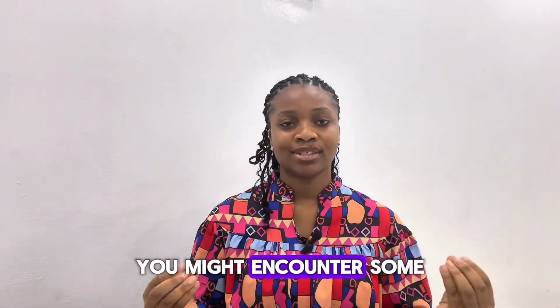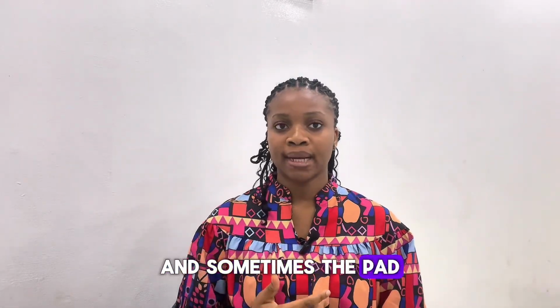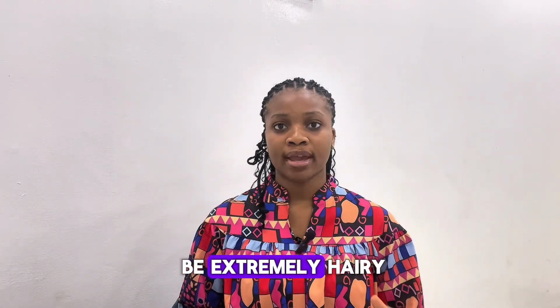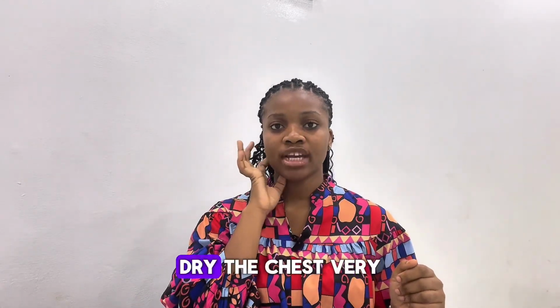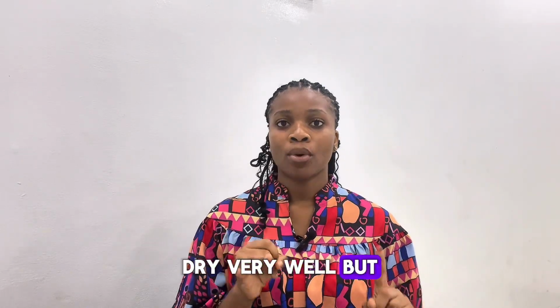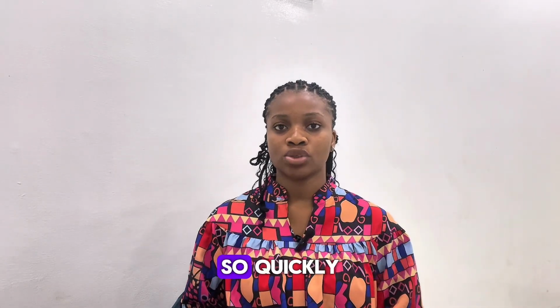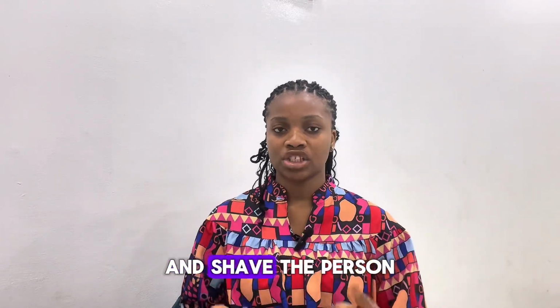You might encounter some common issues while making use of an AED, and sometimes the pad might not stick. It might be as a result of the fact that the chest is wet or the person can be extremely hairy. So in that case, what you do is you dry the chest very well if the patient is wet. But if the person is very hairy, there's always a shaving stick in the safety box. So quickly get the shaving stick from the first aid box and shave the person.